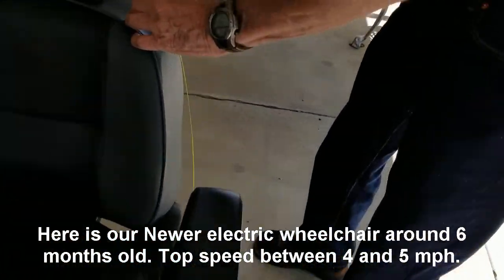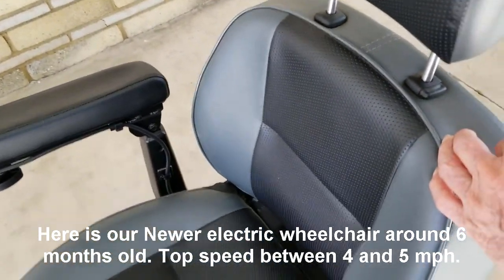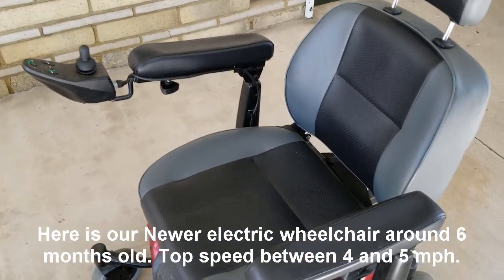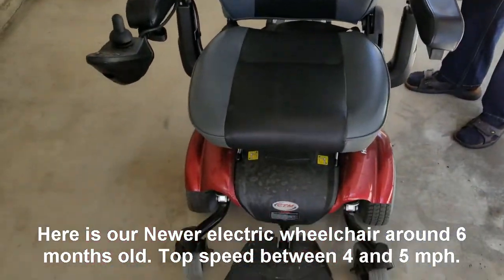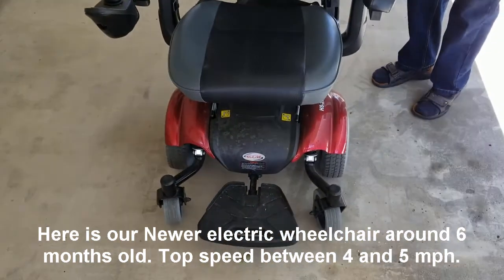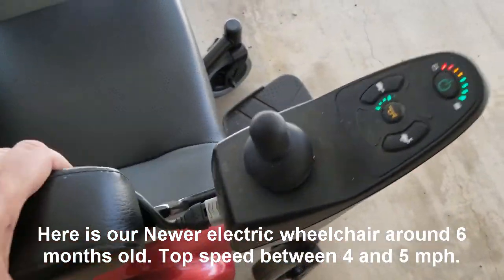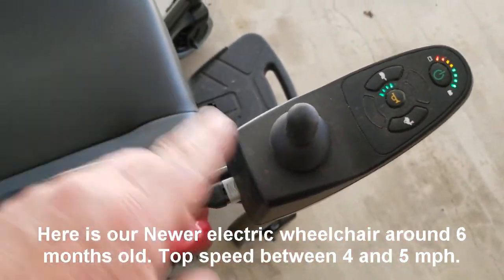We purchased this for around $1,700. Like I say, it's only 6 months old, so it's relatively new. So we're going to start selling this at around $1,500. We took it right out of the crate maybe 6 months ago. Very few scratches. And you've got this handle right here, which can go on either side depending on how you want it.